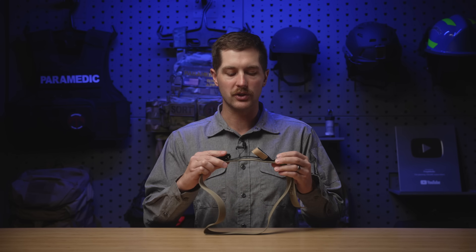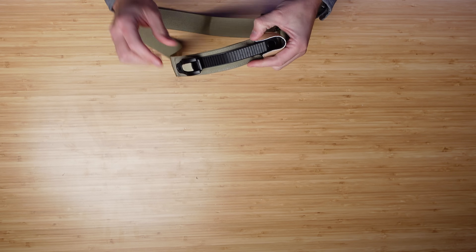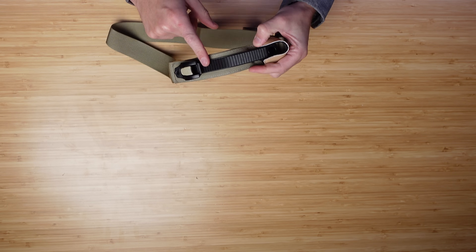This tourniquet can absolutely save your life — it is evidence-based and will work very well in a variety of situations. Unlike a CAT tourniquet or a Soft T Wide, this is not a windlass tourniquet. It actually has a ratcheting strap, not unlike the binding of a snowboard boot, which gives you a couple of additional capabilities.